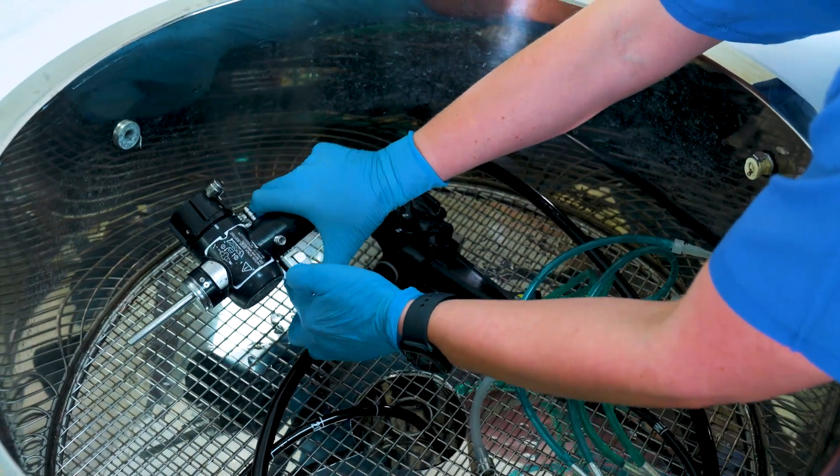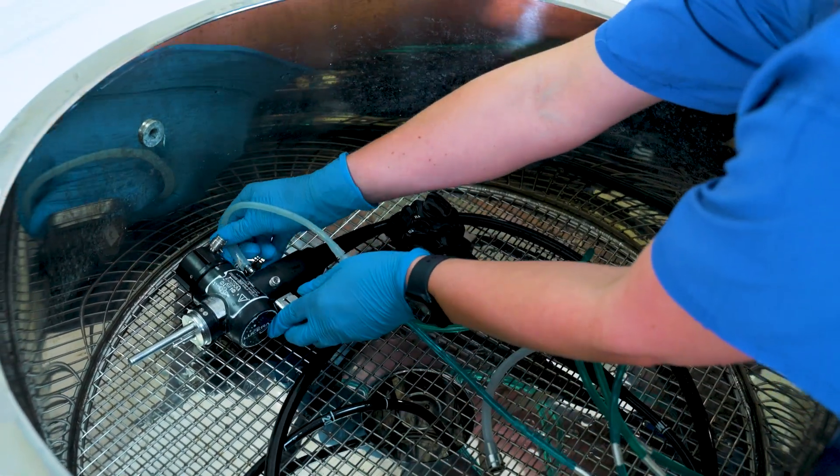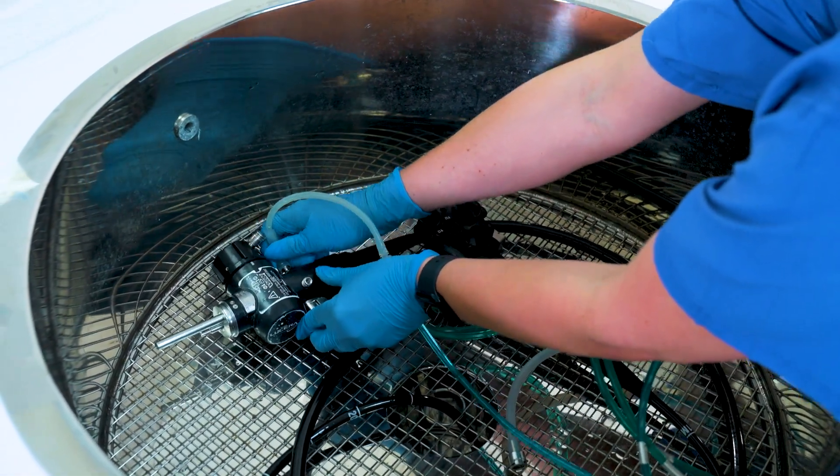The reason the tip of the endoscope needs to sit within the canister of the chamber is so that the tip of the endoscope also gets a clean using the nanoparticles and hydrogen peroxide.